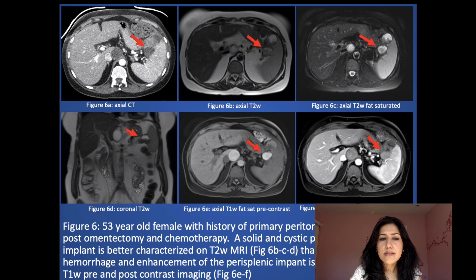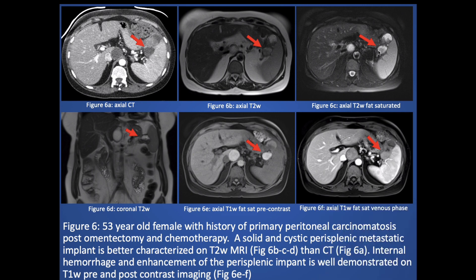Another case: a 53-year-old female with a history of primary peritoneal carcinomatosis, status post-omentectomy and chemotherapy. On CT, there is a hypodense lesion adjacent to the spleen, which is better characterized on the MR images. It shows internal hemorrhage and enhancement on the dynamic images, consistent with metastatic implants.